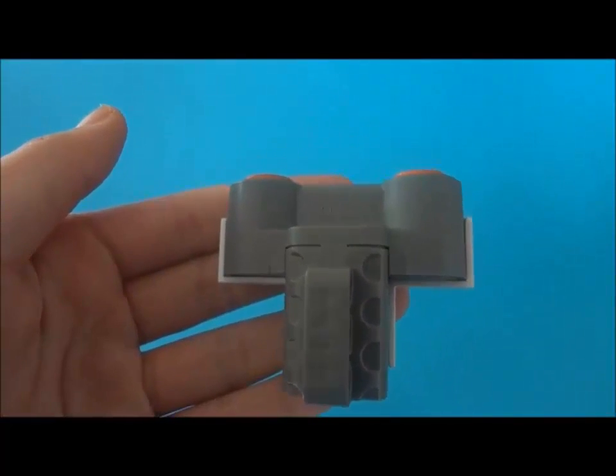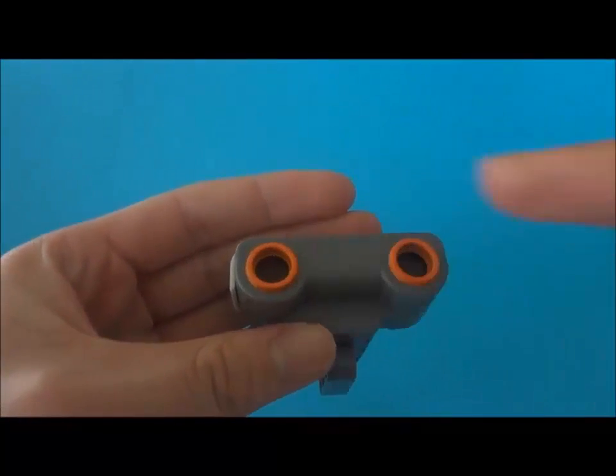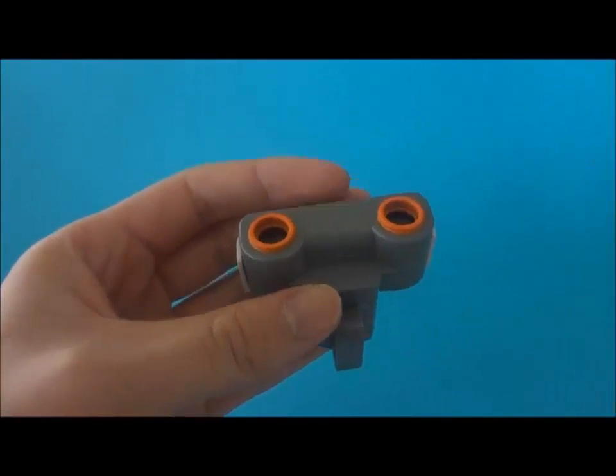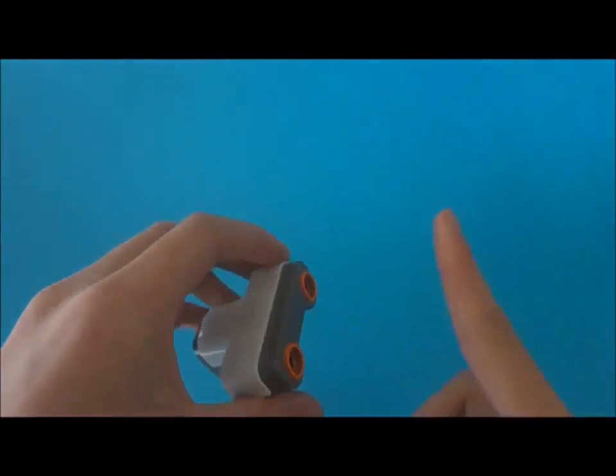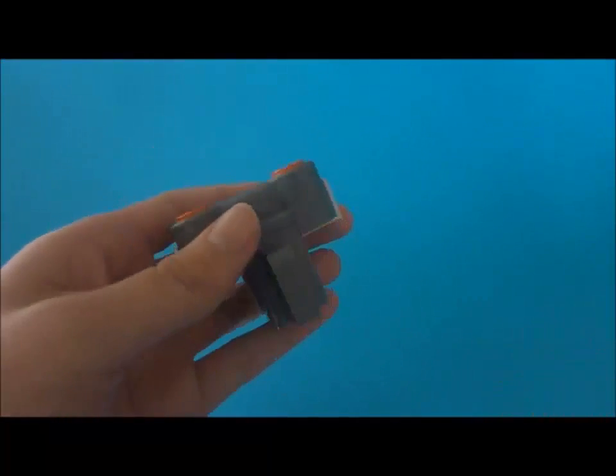We have an ultrasonic sensor, which measures distance using high-frequency sound waves. This would seem ideal, but unfortunately it has a very wide vision, and it isn't accurate below distances of 4 centimeters. Also, it is huge and distracting on the face.